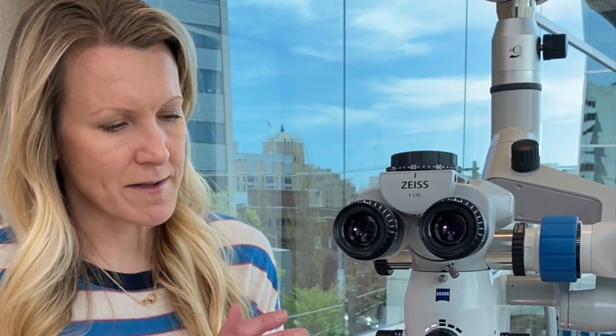I find this is really handy when I first purchase a scope and I'm getting used to the light source. Every once in a while, maybe I want to dial it down. It's just too bright for what I'm working on, but you can make a slight modification with that dial and change it there. It also has all sorts of filters on it.